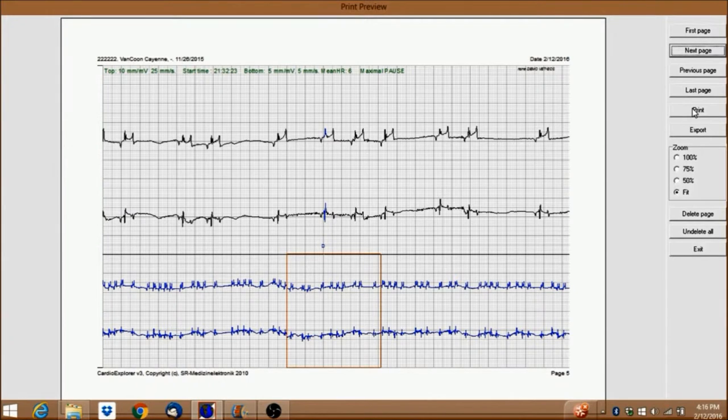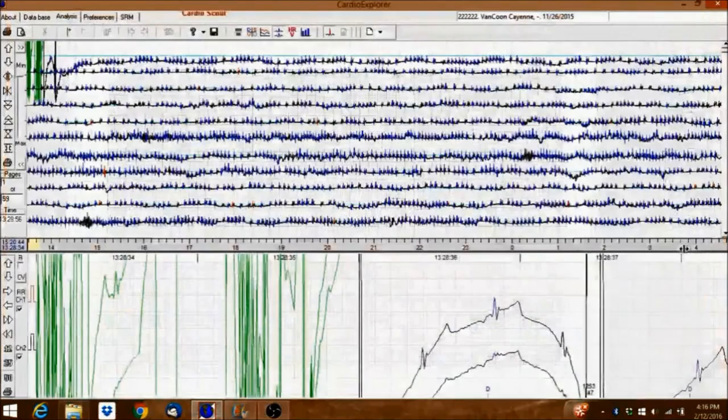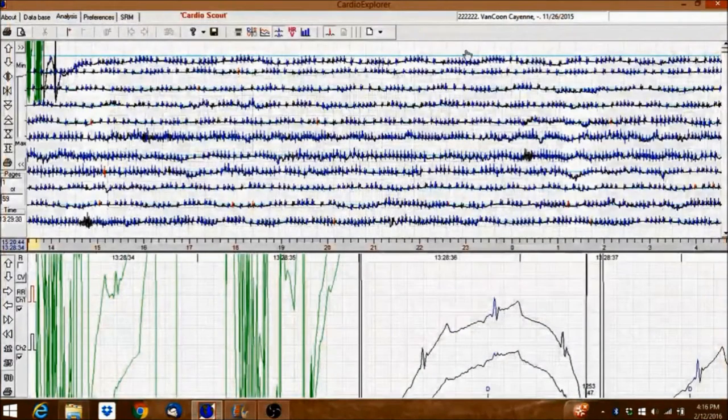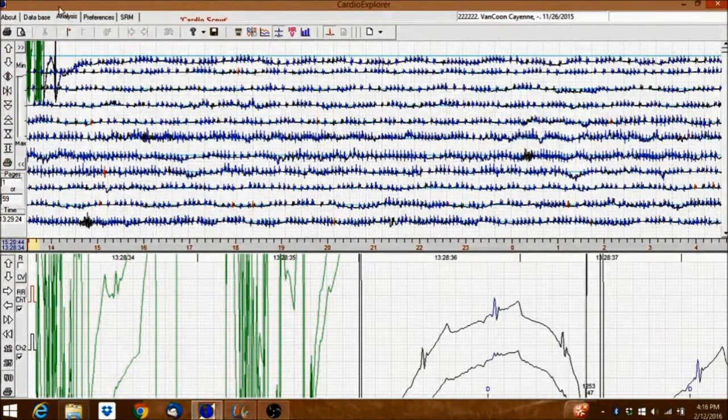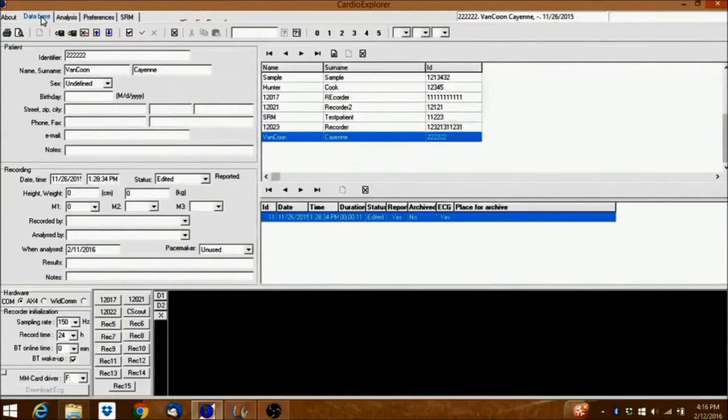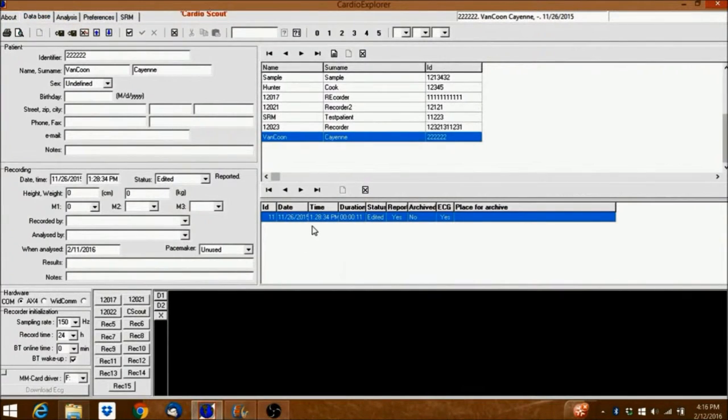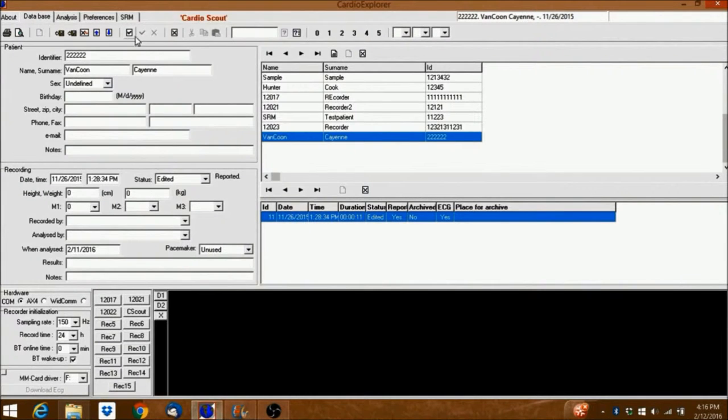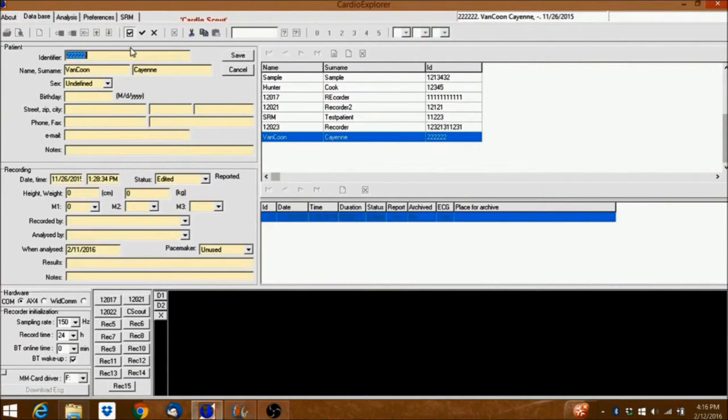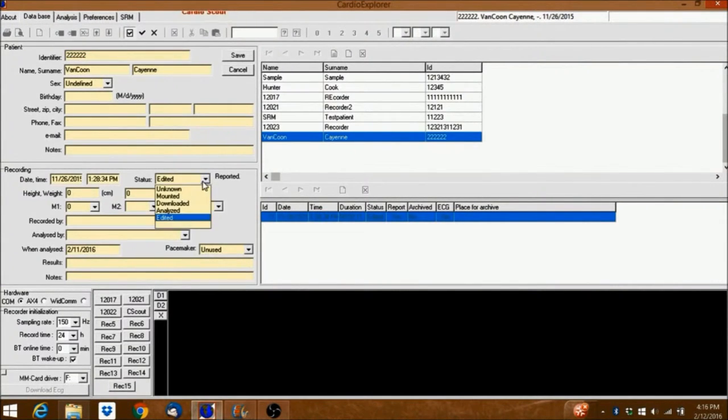Go back to the Database tab now and change the recording status to Analyzed. When you're done, click Save.